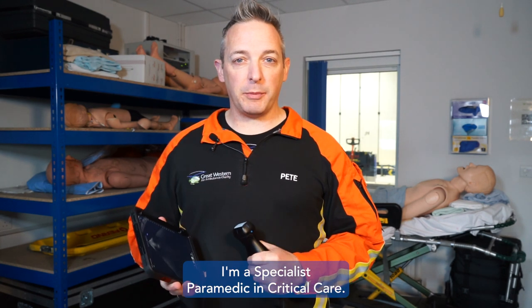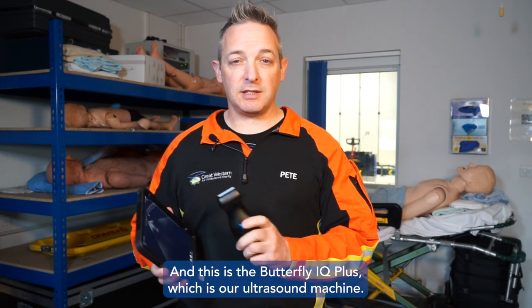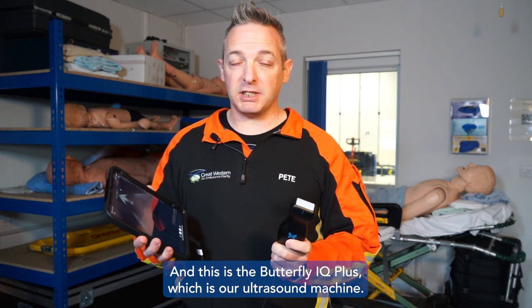Hi, I'm Pete. I'm a specialist paramedic in critical care and this is the Butterfly IQ Plus, which is our ultrasound machine.